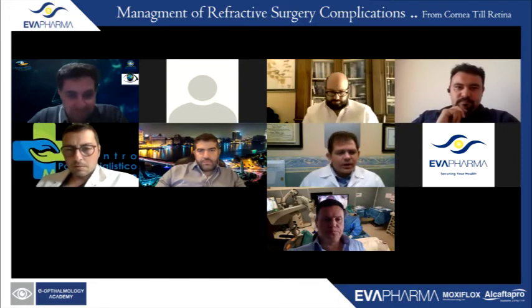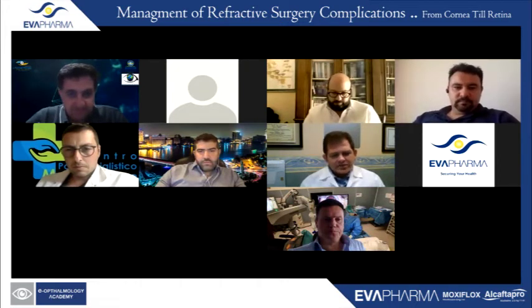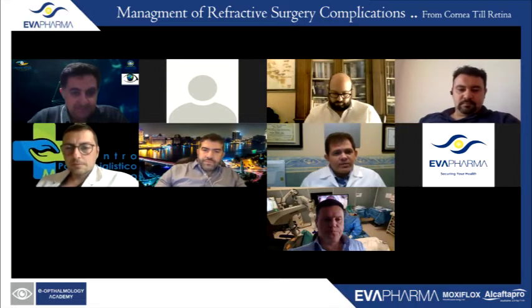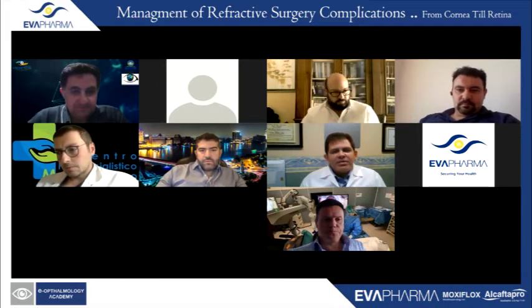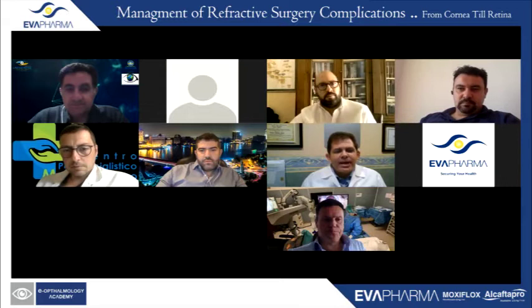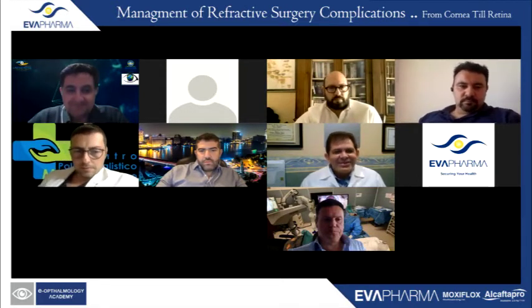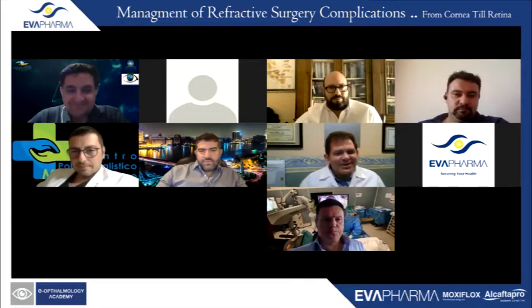Well, it's a very good question, Ashraf. And I am not the refractive police saying you should not do surgery if you don't have this map or this exam. We should understand that we have evolved, and every center, every refractive surgeon in the world should do whatever they think is safe and worth doing. But I would say that a lot of people come, everything looks normal, but the Pentacam has a bit of yellow. It's not everything normal. If it's everything normal, everything is normal. But what is everything?